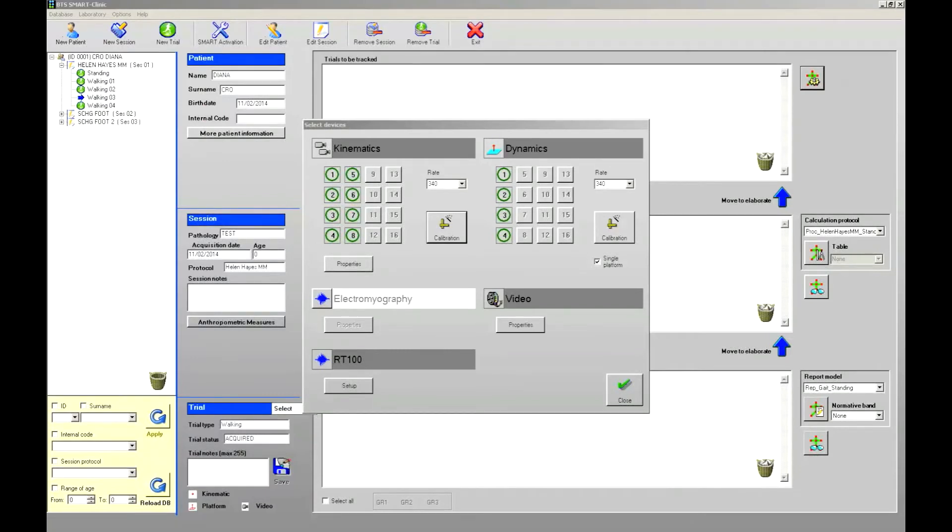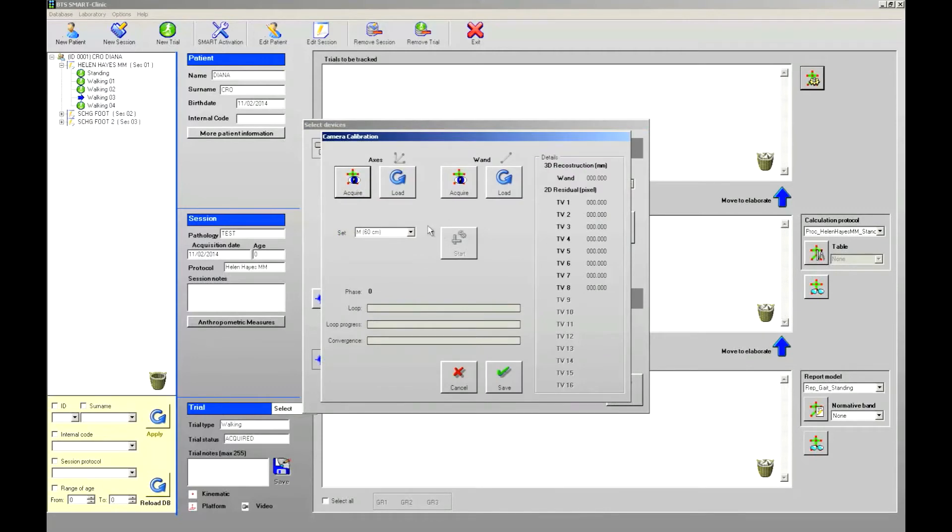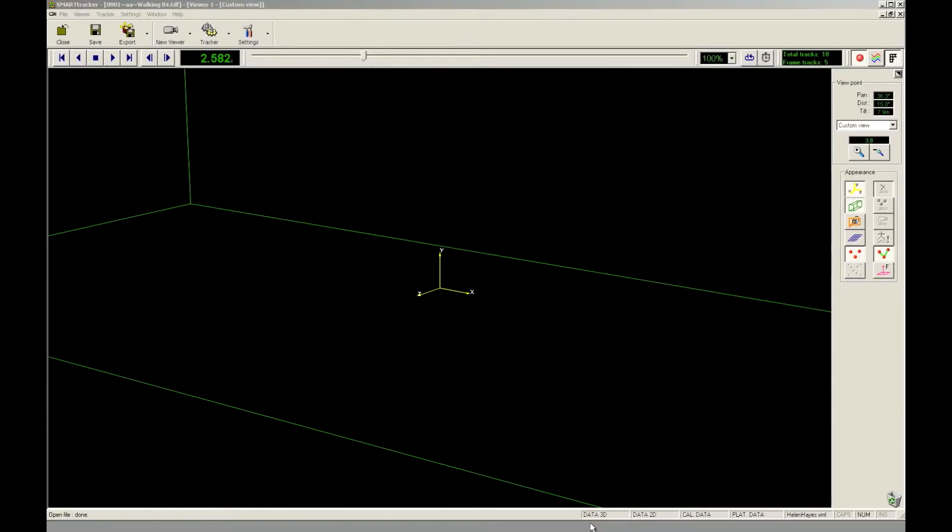By selecting the camera calibration button, the application will help us follow the required steps: the static calibration, or capturing the axis position, and the dynamic calibration, performed by a wand as shown on the software. The goal of the static calibration is to define the position and the orientation of the global reference system of the 3D workspace — that means defining the position of its origin and the orientation of its x, y, and z axes. After the 3D reconstruction, all the markers' trajectories will be defined with respect to that global reference system.